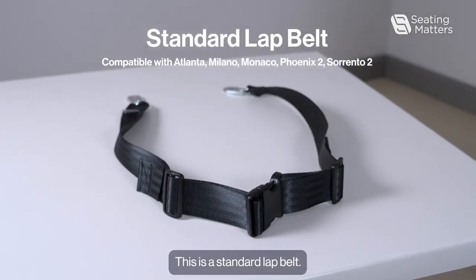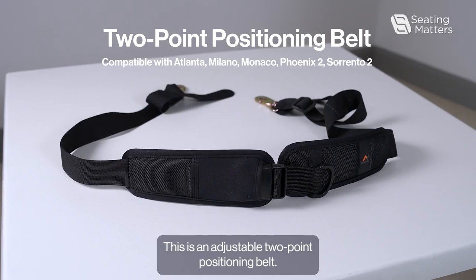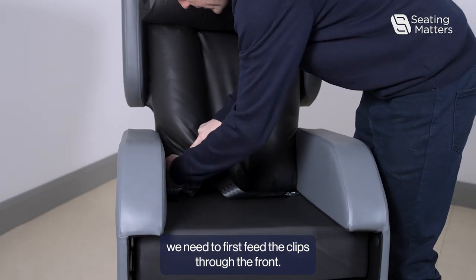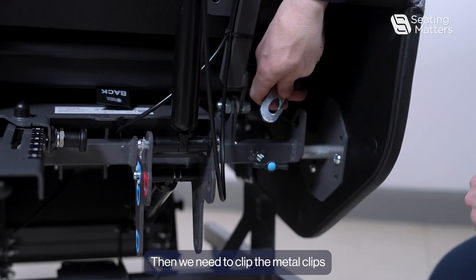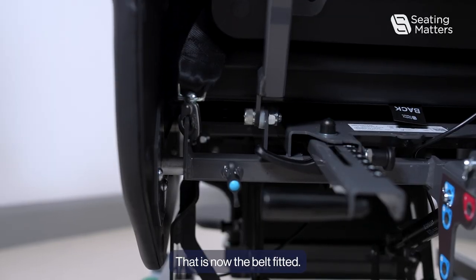This is a standard lap belt. This is an adjustable two-point positioning belt. To fit any of the belts on the Seat Matters chairs, we need to first feed the clips through the front, then clip the metal clips into the attachment points. That is now the belt fitted.